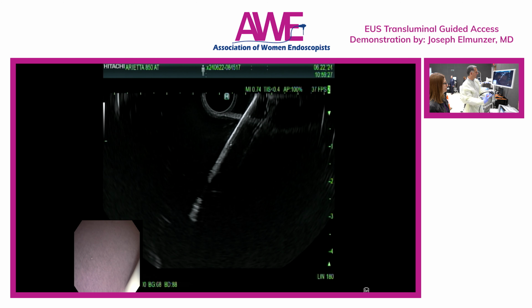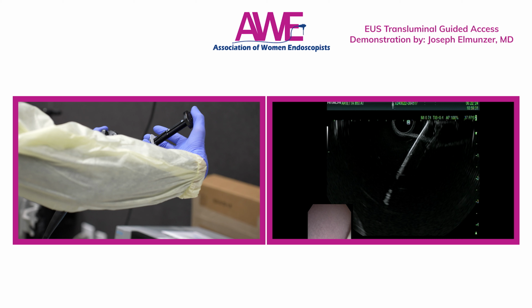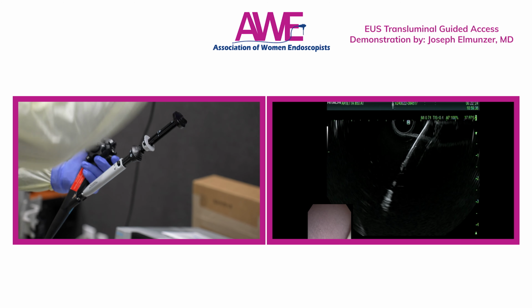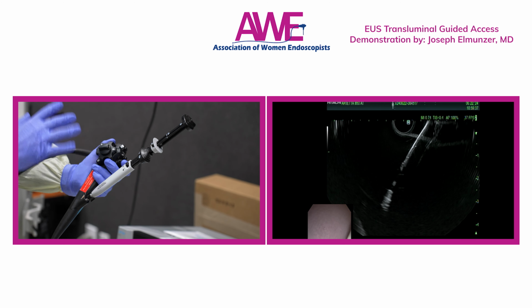And then this process is ideally done under direct visualization, and we're going to deploy by bringing our fingers together. And so as we do that, if you look at the screen, you'll see the tip does move away, and that's what we have to be cautious about. But as you do that, it'll start to deploy.